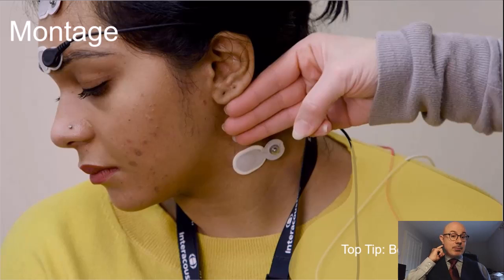Where to place it on the muscle? Well, it's in about the top third of the sternocleidomastoid muscle. And we have to be careful. If we place it too low and in the wrong position, we can find a null point where we're not going to actually record the response from that muscle.